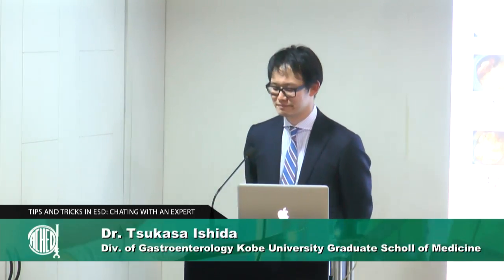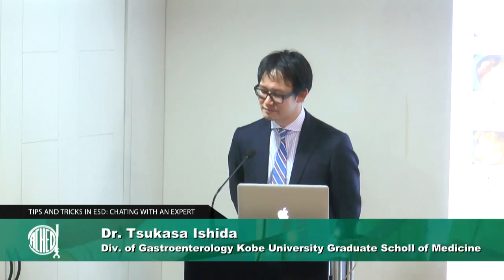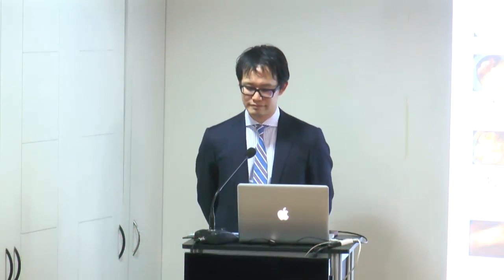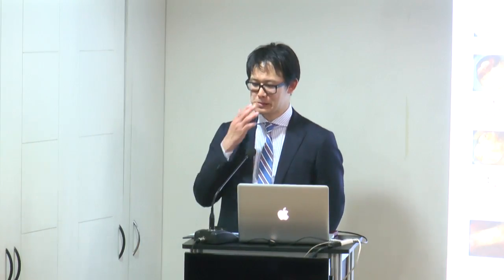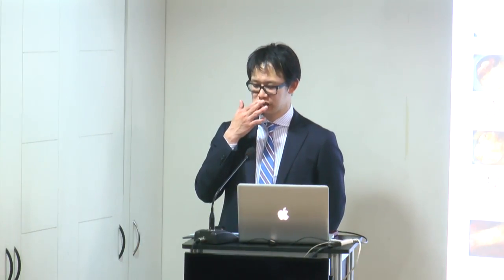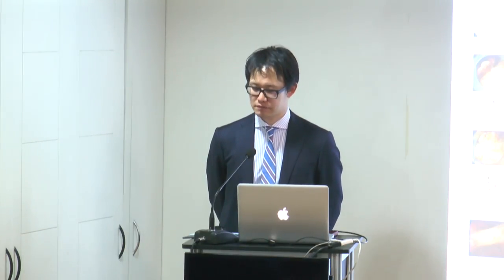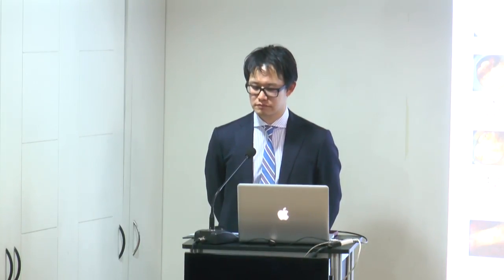Now, yeah. So just 10 seconds, pero tenemos en el fondo disponible en Chile, no sé si en otros países de Sudamérica, usted dígame por el chat, SigmaVisc, que hasta donde yo sé el doctor Toyonaga ha hecho en Italia ESD con SigmaVisc y no le encuentra ninguna diferencia clínica al MucoUp. Y nosotros también hemos tenido la oportunidad de ocupar los dos y en realidad no hay mucha diferencia clínica. Así que tenemos SigmaVisc, que es muy similar y de hecho es muy similar en precio también, es carísimo. Así que quizás esa es una alternativa.